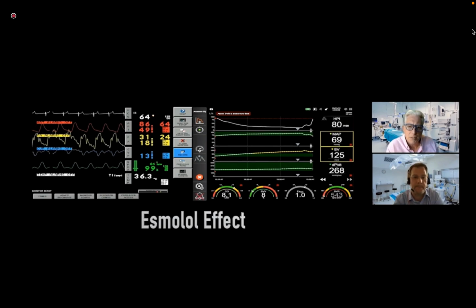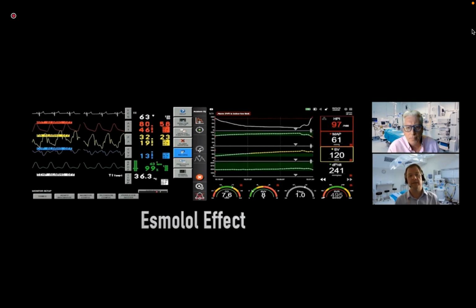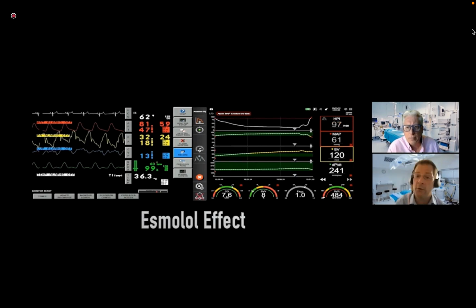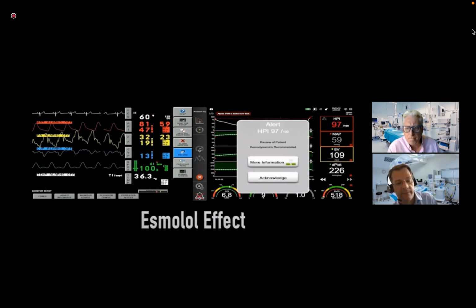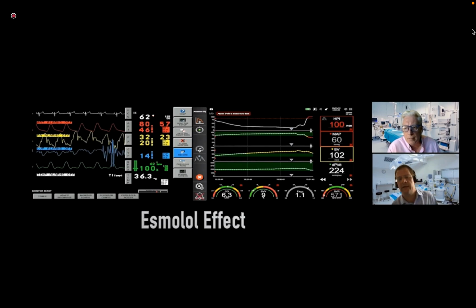So is it not just part of the effect a change in heart rate as well, Simon, with the beta blocker? Is that what you'd anticipate too? So we should see a change in our heart rate. It should start to decrease, some negative chronotropic effect, and that actually, Monty, might cause our stroke volume to increase slightly at first as we get improved left ventricular end diastolic volume. I think we saw a little blip up there in stroke volume, but now we start to see that true effect of esmolol.